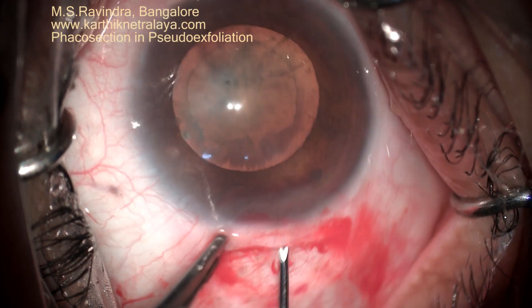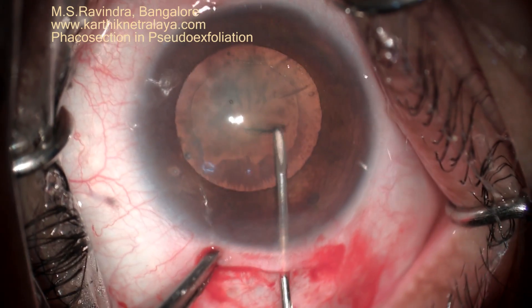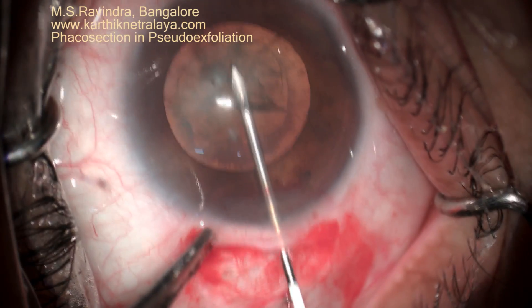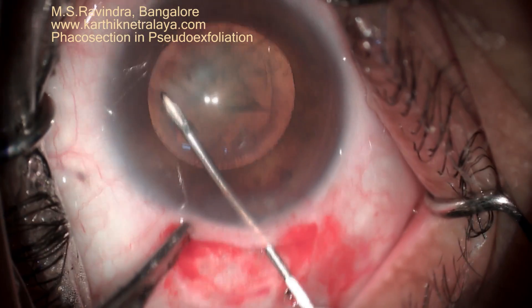Surgery for pseudo-exfoliation and cataract. The pupil dilates to about 6 mm. A sclerocorneal tunnel is created and through the tunnel floor entry technique, capsulorhexis is being done.